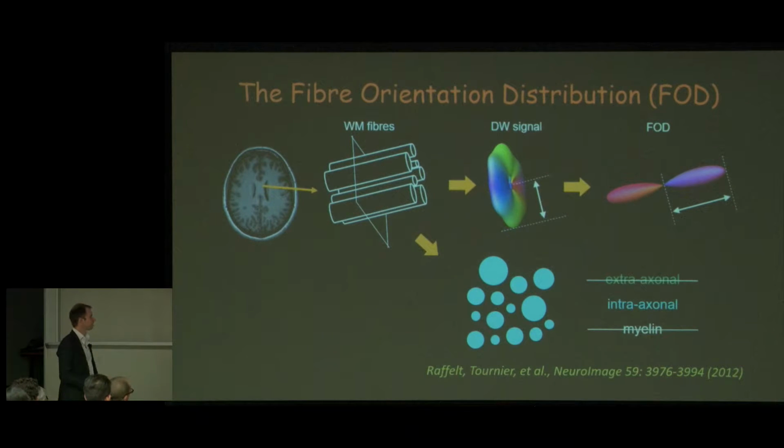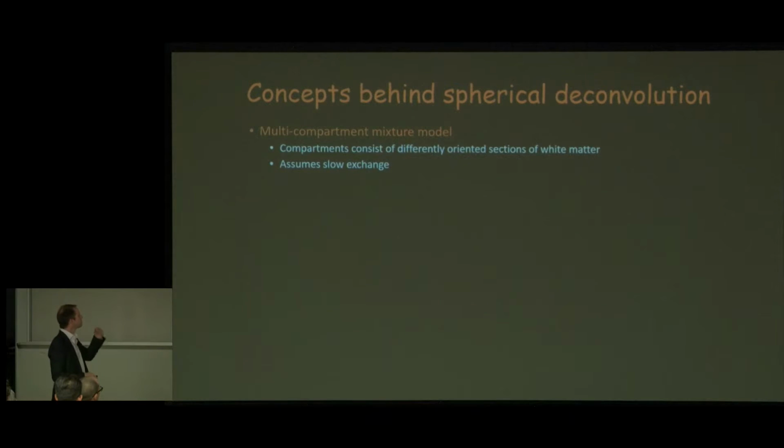So that means that we're basically left with just the intra-axonal signal, which we showed earlier, with the large pulses that we use in the clinic, is essentially proportional to the intra-axonal volume and not modulated by the axon diameters. So it's a really nice, clean interpretation. Now, this is just a cartoon of the white matter, and of course things are more complicated than that. But I think this is a really useful way of thinking about the signal that we get from spherical deconvolution and how to interpret it. It's not perfect, but I think it's pretty good.